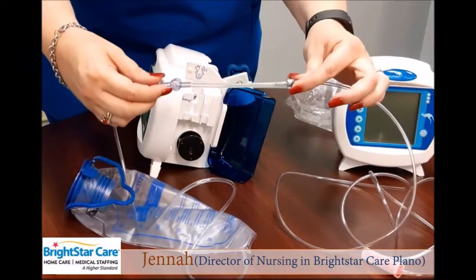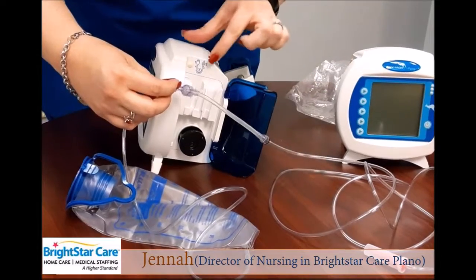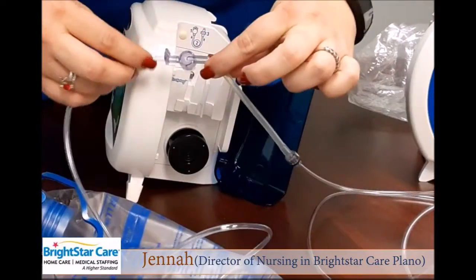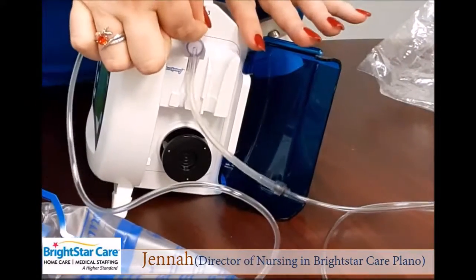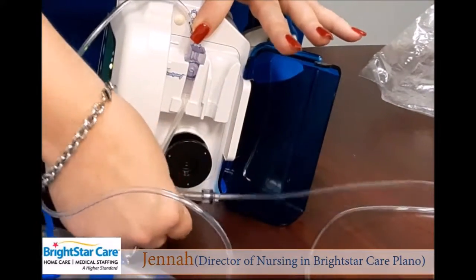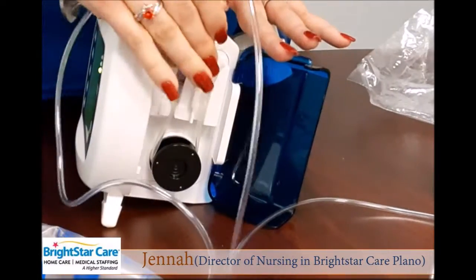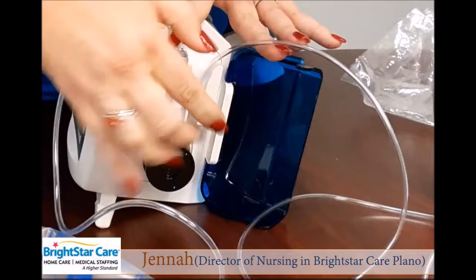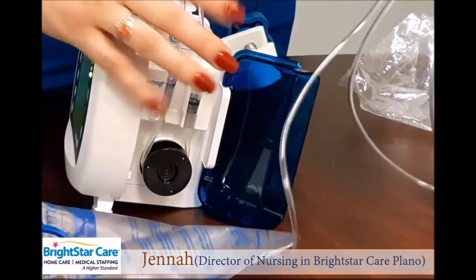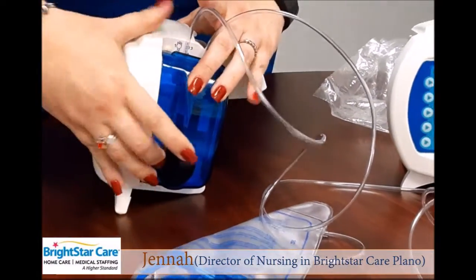This loading piece will only fit into your pump one direction. In case you ever forget which direction to load your pump, there's a handy photo that tells you steps 1, 2, and 3. For step 1, you'll take your tabbed piece, slide it down into your pump. Step 2, you'll stretch under the black wheel, pull up, and then for step 3, slide the final piece into the base. You'll then make sure both of your lines are up out of the way, and you'll swing your door closed and snap it shut.